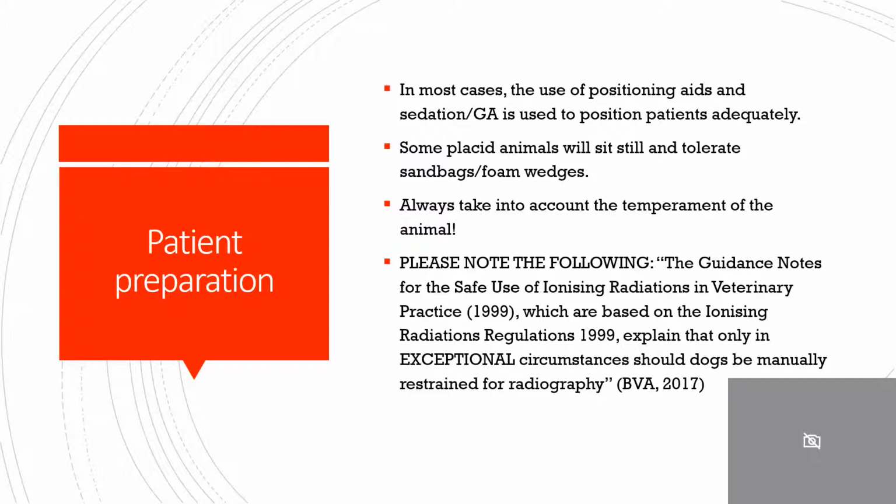In most cases, the use of position aids and sedation or GA is used to position patients adequately. Some placid animals will sit still and tolerate sandbags or foam wedges. Always take into account the temperament of the animal. Please bear in mind that it is not appropriate to use ties for animals that are not anaesthetised, as it could potentially cause them to harm themselves, whereas sandbags and foam wedges are far safer to use because we wouldn't be anchoring those to the table.